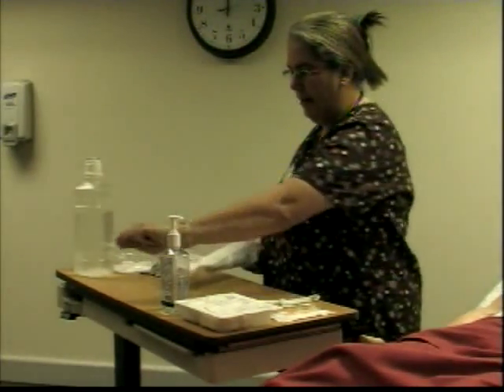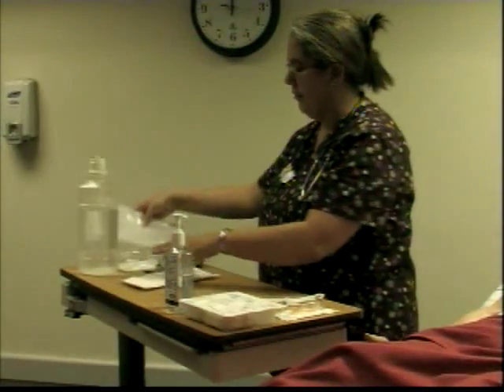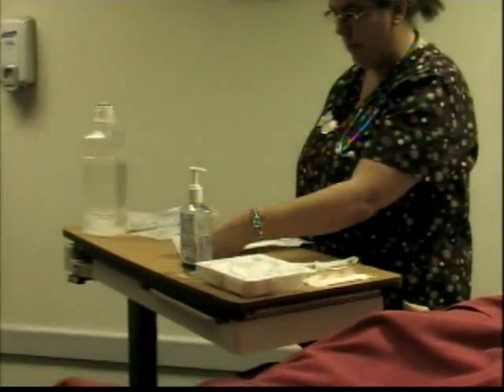And I want to open it. And you already have done all these things in 11:15. You already were taught how to open all these packages. So you're going to open it.